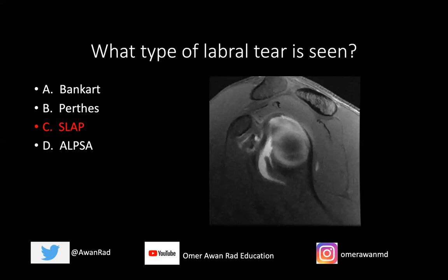This is a SLAP tear — a superior labral anterior to posterior tear. Looking at the sagittal image, we can identify the supraspinatus muscle, infraspinatus, teres minor, and subscapularis. The subscapularis is anterior, and this is posterior. This circle is the glenoid process of the scapula, and the black circle around the glenoid is the labrum — a static stabilizer of the shoulder that is dark and hypointense on all MRI sequences.